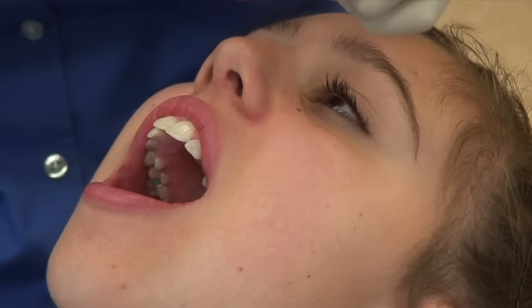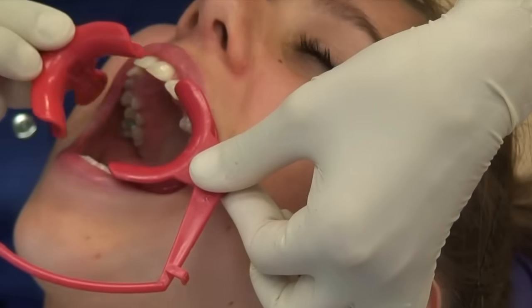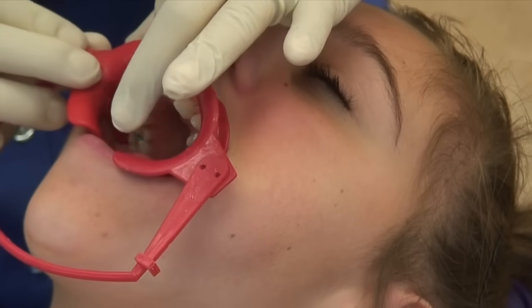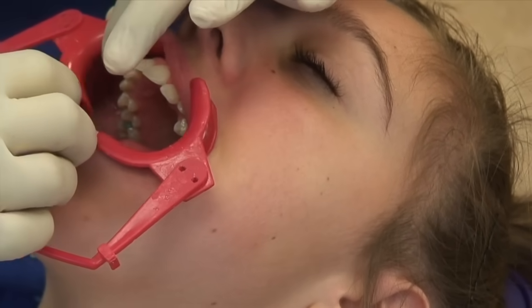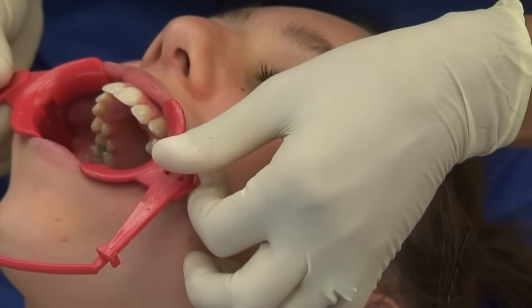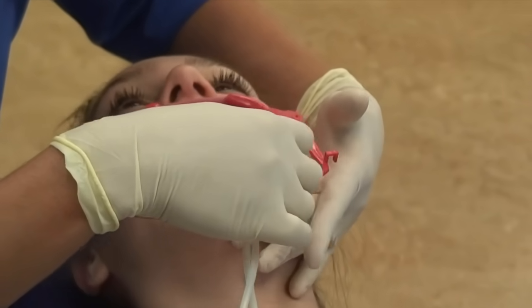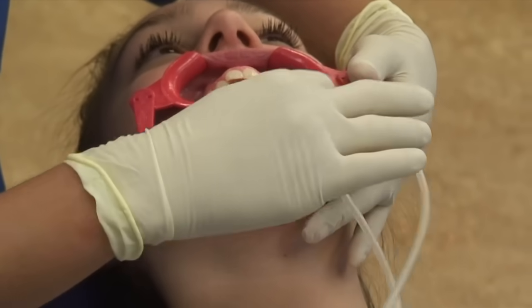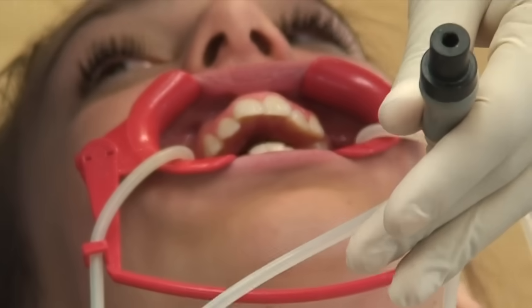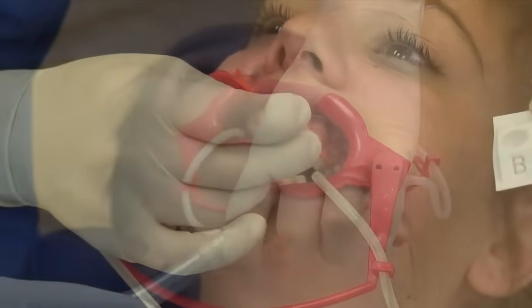Okay, we're going to walk you through putting on braces, and I'm going to use this patient that we're going to call Sarah. We're going to put on Sarah's braces right now, and we start off by putting on a little cheek retractor. This cheek retractor holds the lips and cheeks away from the teeth, which you'll see. Then we also use a little device that holds the tongue away from the teeth. Now, the reason we want these in there is we want to keep the teeth as dry as possible. Once we start preparing the teeth and working on them, we don't want the lips, the saliva, or the tongue to interfere with what we're doing.